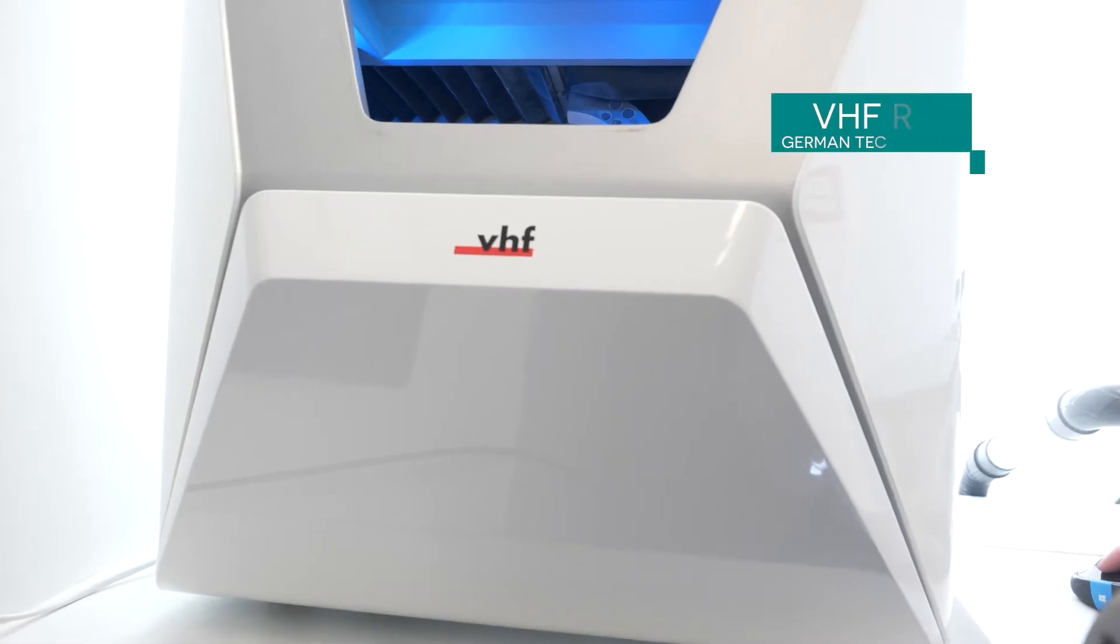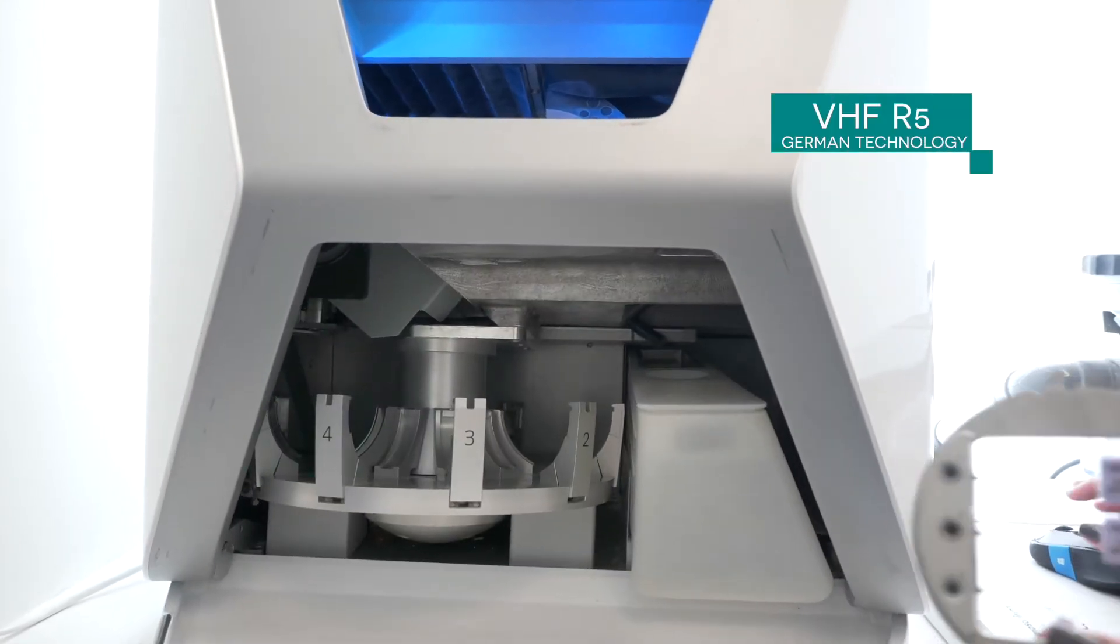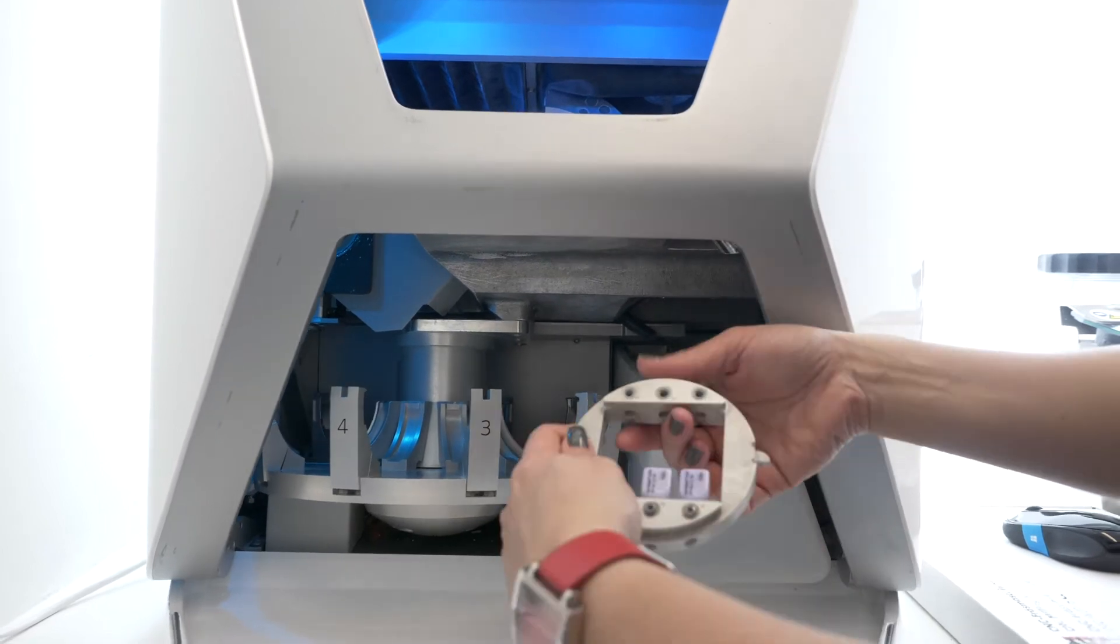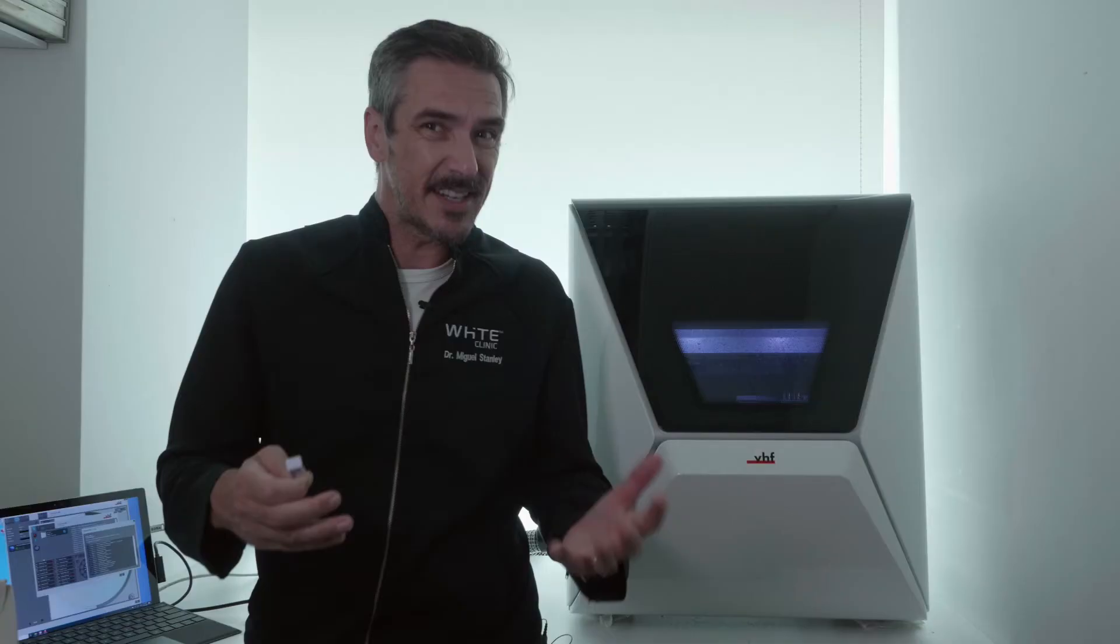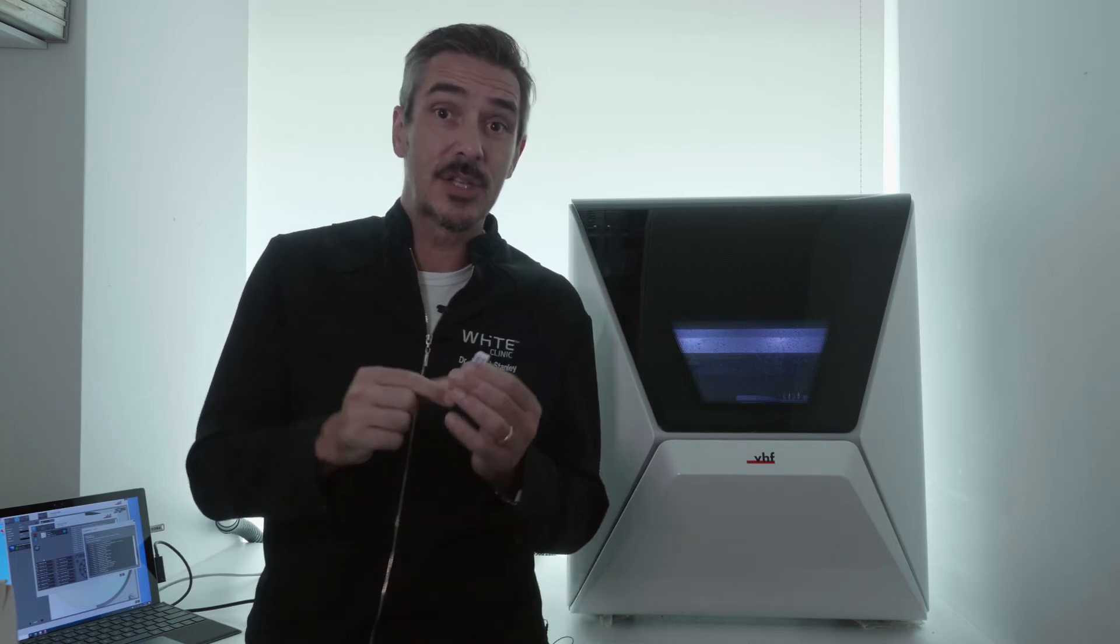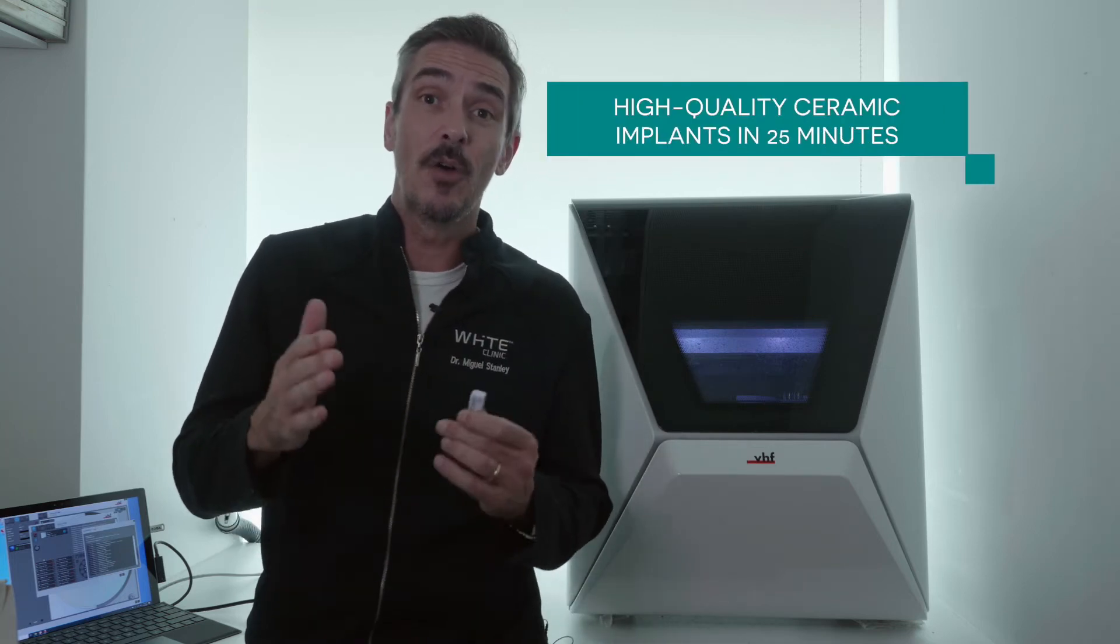This is the R5, a 5-axis milling machine manufactured in Germany by VHF. This really cool machine is technically a robot that can turn this little hardened block of ceramic into a beautiful tooth in only 25 minutes.